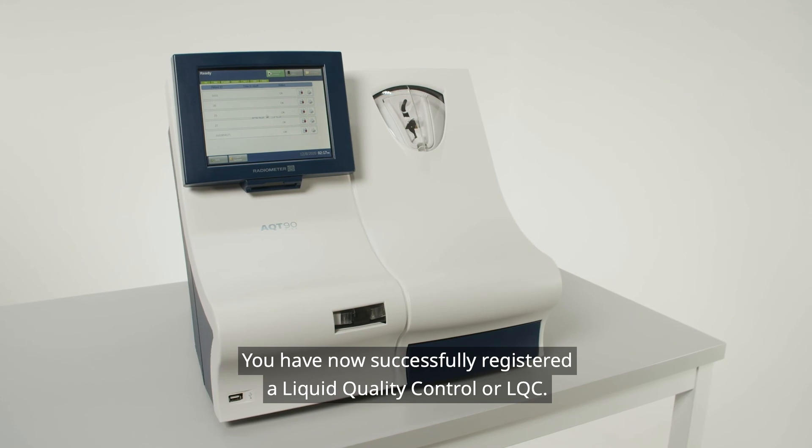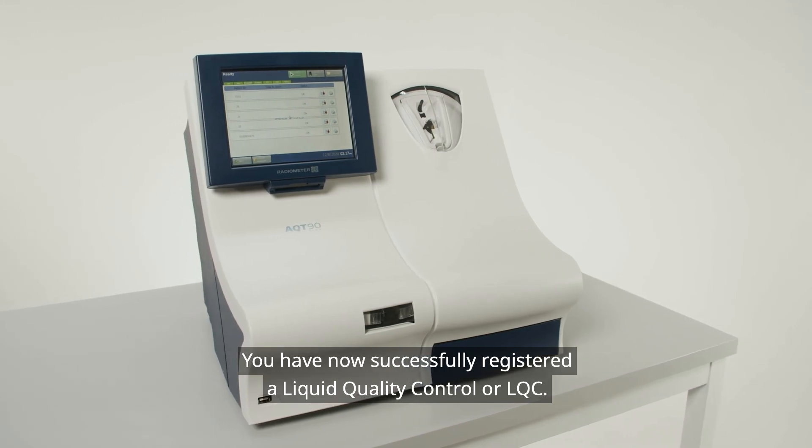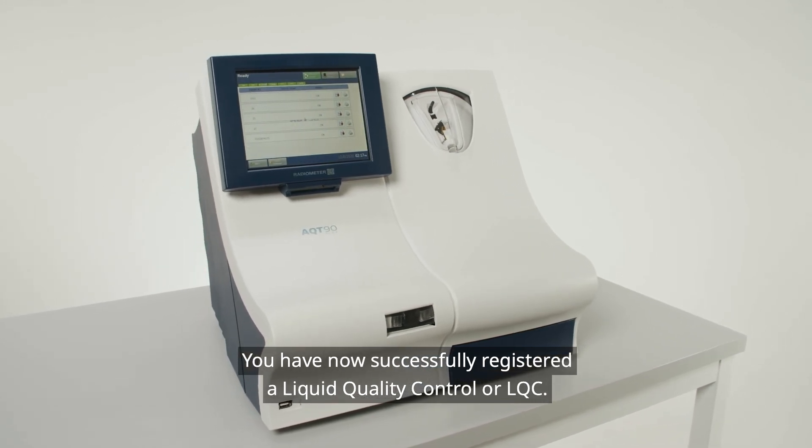You have now successfully registered a Liquid Quality Control, or LQC.